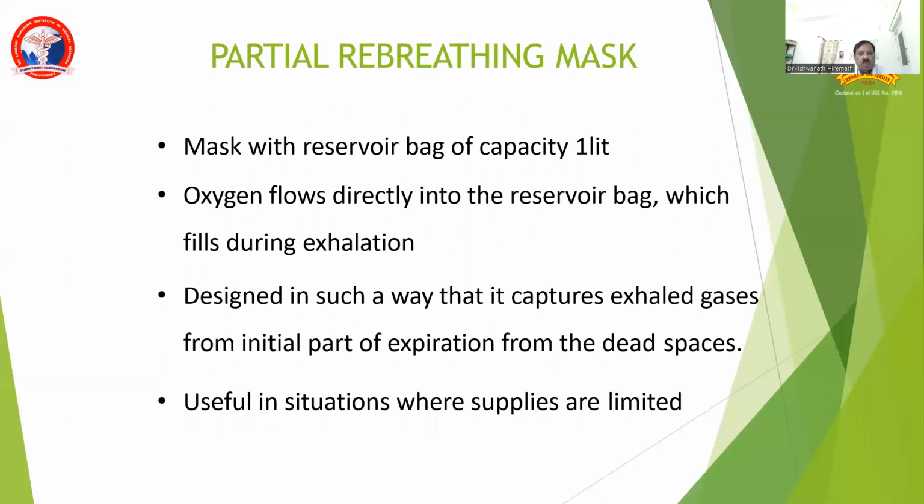Next, if the target oxygen content is not achieved, we can go for partial rebreathing mask, which involves a mask with a reservoir bag of capacity 1 liter. Oxygen flows directly into the reservoir bag, which fills during exhalation.